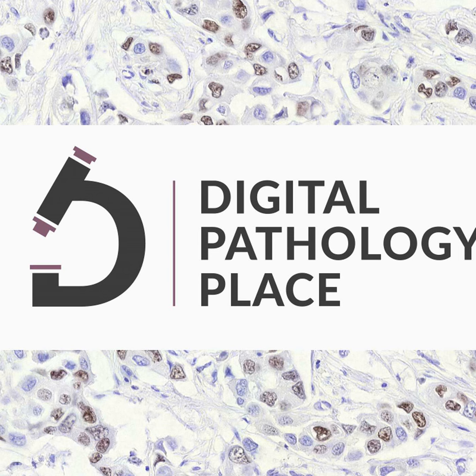Digital pathology also plays an indispensable role in biomarker-driven drug trials and the evaluation of drug safety and efficacy. In biomarker-driven trials, the use of digital pathology and image analysis enhances the ability to detect and quantify biomarkers in tissue samples. This is crucial for personalized medicine as it allows for better stratification of patients and tailoring of treatment based on their biomarker profile.